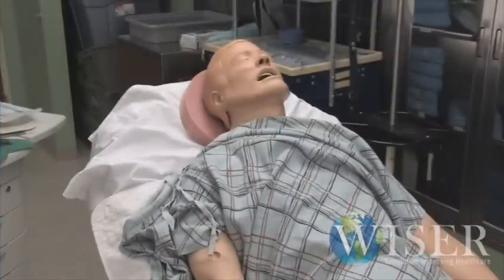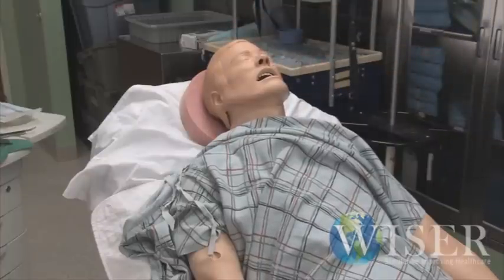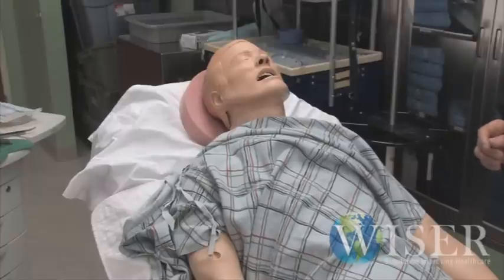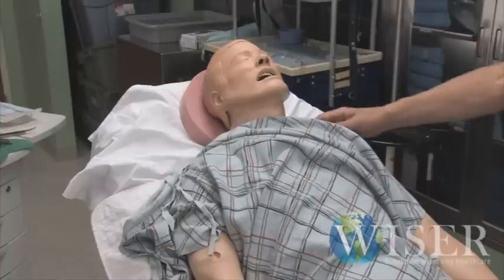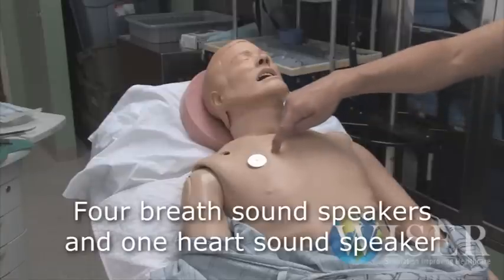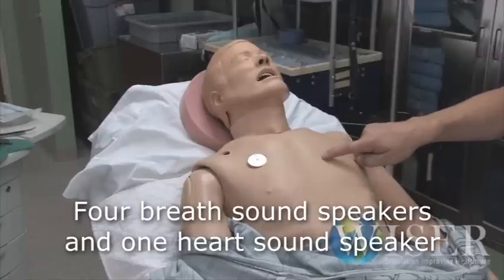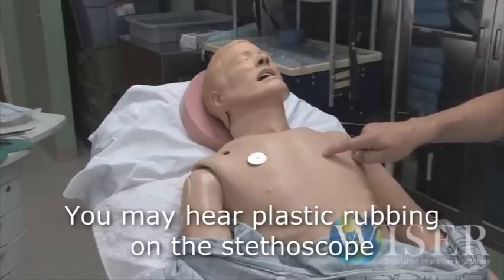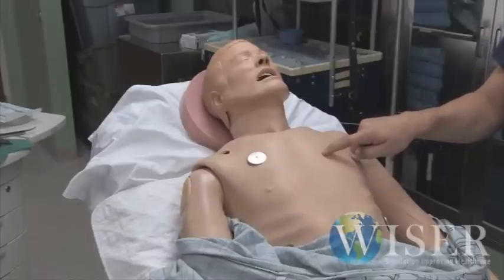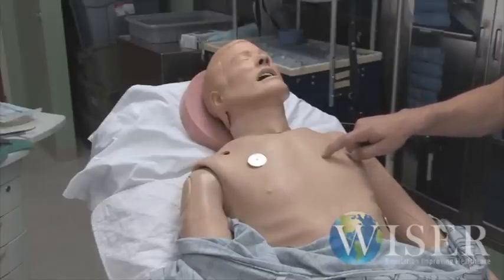This is our SimMan simulator. You can see that he never opens his eyes. So if you have any questions about his level of consciousness, be sure and ask, and a cohort during the simulation will cue you into whether or not the patient is conscious or not, if it's not otherwise obvious from the simulation. He's breathing spontaneously now. It's important that you know that he's got speakers here, here, here, and here for breath sounds and a heart sound speaker here. A lot of times when you listen to him with a stethoscope, you'll hear plastic rubbing on your stethoscope. So it's completely appropriate for you to say you hear crackles, and then a cohort might come in and say that's correct, doctor, or why don't you listen again because I think they're clear.